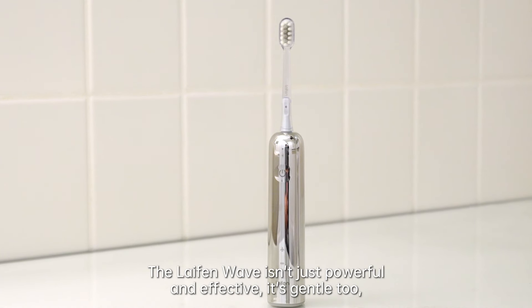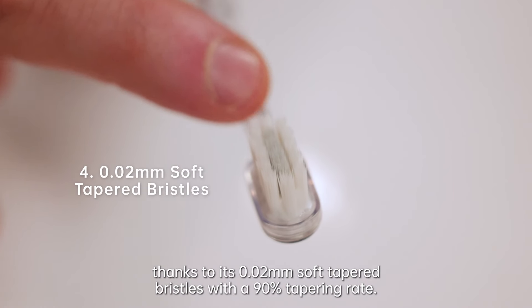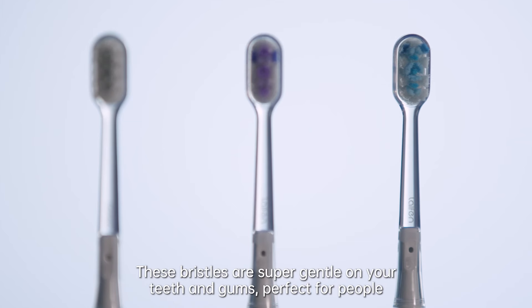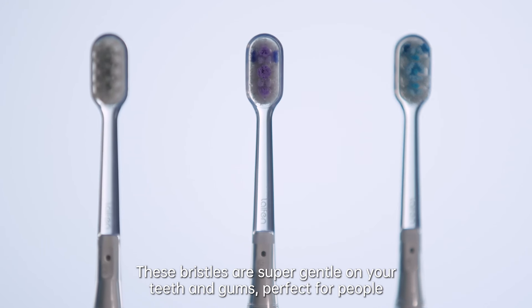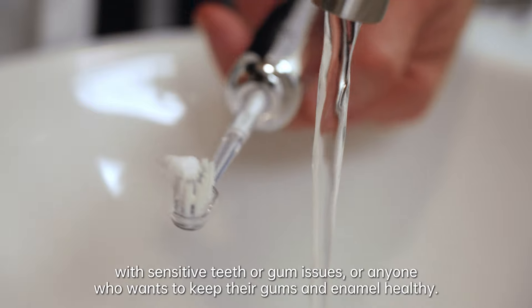The Laifen Wave isn't just powerful and effective — it's gentle too. Thanks to its 0.02mm soft tapered bristles with a 90% tapering rate, these bristles are super gentle on your teeth and gums, perfect for people with sensitive teeth or gum issues, or anyone who wants to keep their gums and enamel healthy.